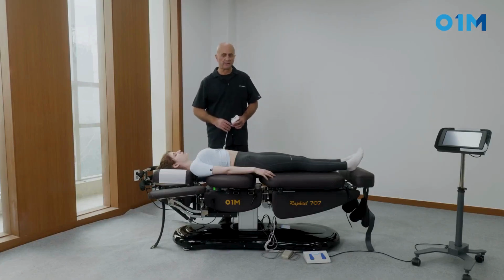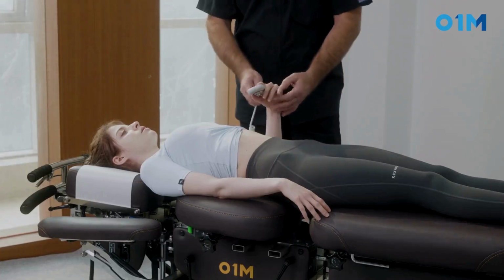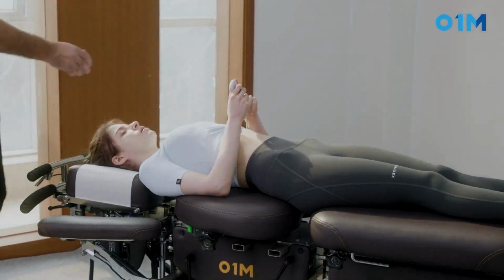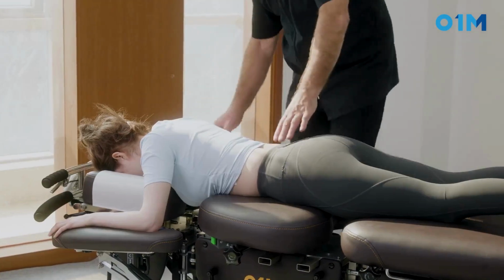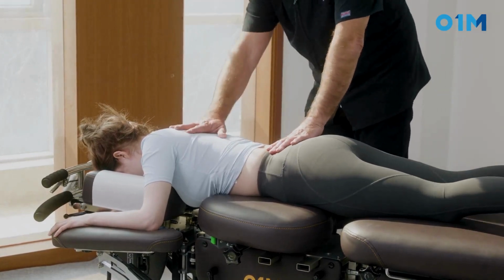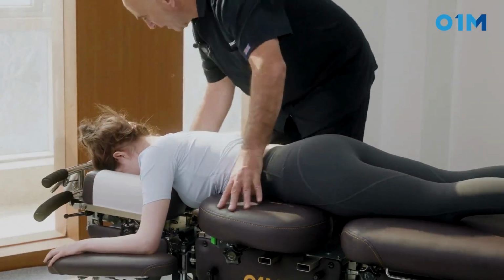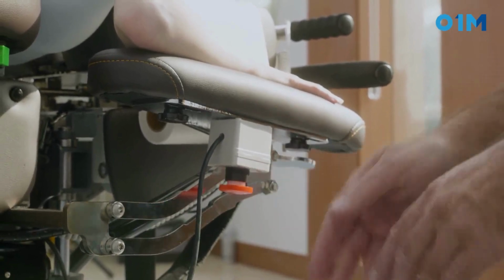As the patient is supine, in traction, axial traction or flexion distraction, we're going to give her that, and she will be able to press on that button and turn off the table. So can you hold that on? And basically it will stop the table. So we have this function, and the other function is going to be under the table, the red button on the right side. You're going to find here on the right side a red button that you will press down if you have any type of pain as we perform that. So I'm going to lower that for you. Press down, stops. Twist it, open again.